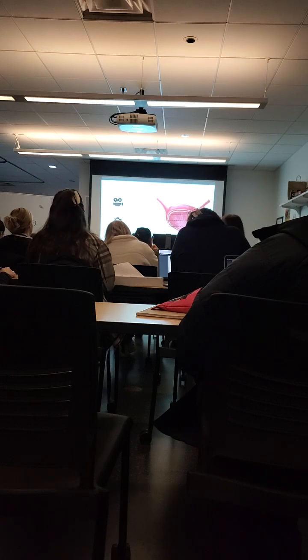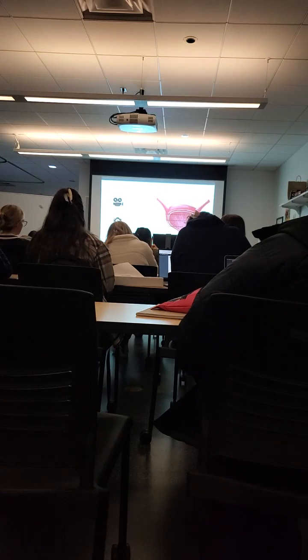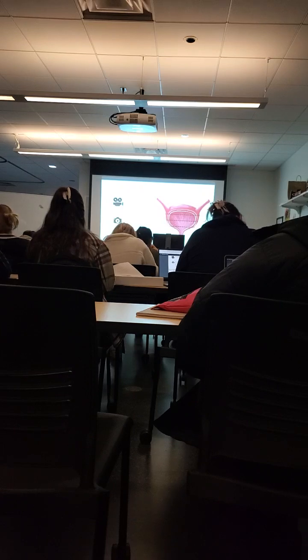I always take a picture when I start, and if I can't get anything, you wait 5 minutes, and you will be adjusting your color. You'll be closing your sector width on your color box. You'll do all kinds of things. You'll have them turn their head and cough, and still sometimes nothing. Keep them in a supine position the whole time. But you can have them turn their head to the right or the left, give you a cough, and whatever side you had them turn to is where the jet will actually show. It's weird.